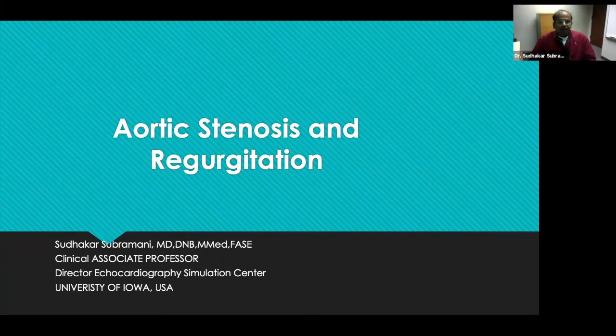Hi, I'm going to talk today about the role of echocardiography in the assessment of aortic stenosis and regurgitation.